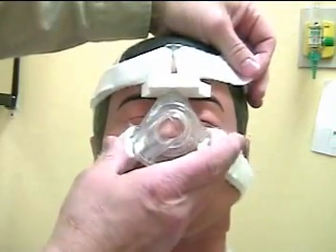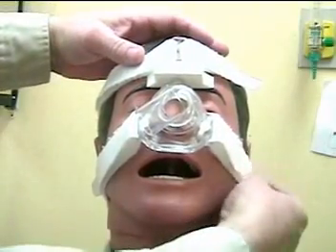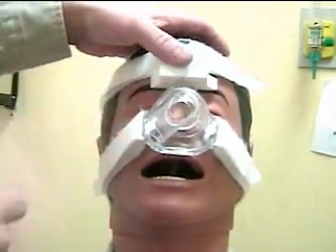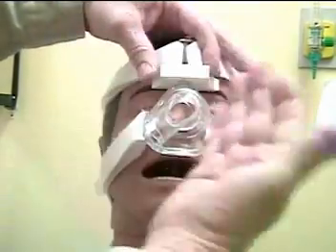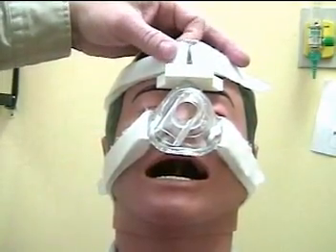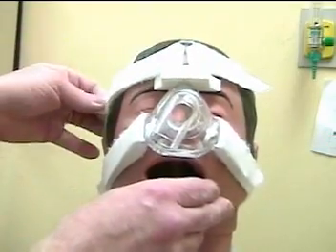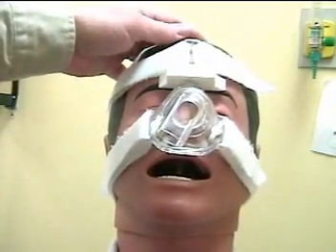As we fit the bonnet and the mask, we want to make sure that the mask is straight on the patient, not too low on the mouth, and not over the eyes. Readjust for a nice firm fit, making sure that the block, the spacer, keeps the mask straight within the patient's face and doesn't cause gapping one direction or the other. Readjust slightly without over-tightening and causing pressure irritation on the face.